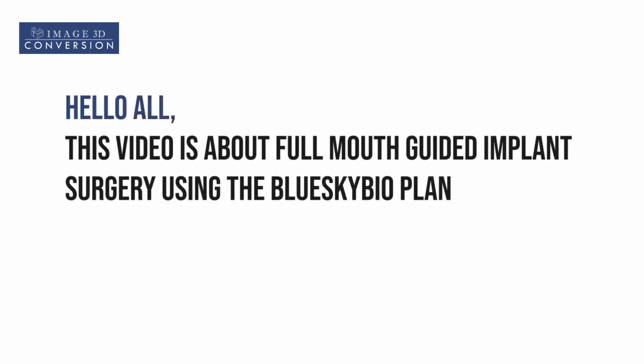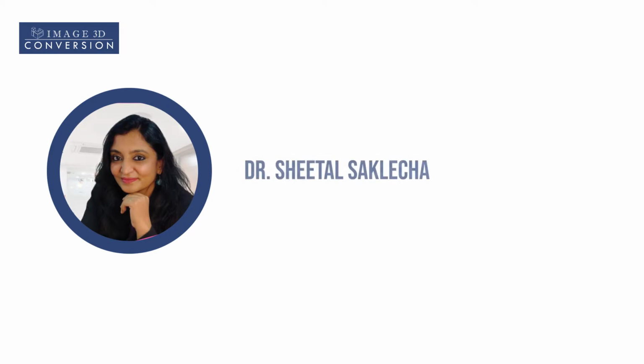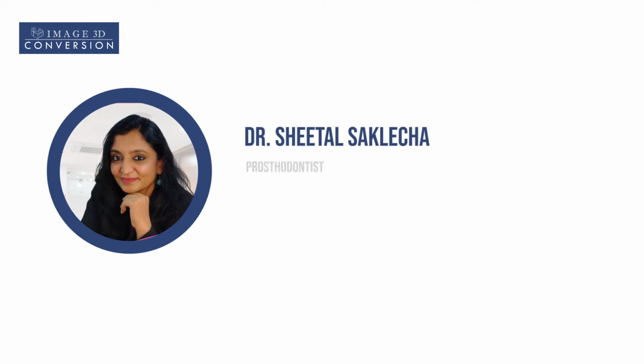Hello all. This video is about full mouth guided implant surgery using the Blue Sky Bioplan by Dr. Sheetal Saklecha. Dr. Sheetal Saklecha is a leading prosthodontist and implantologist and the owner of Suntosh Dental Care.